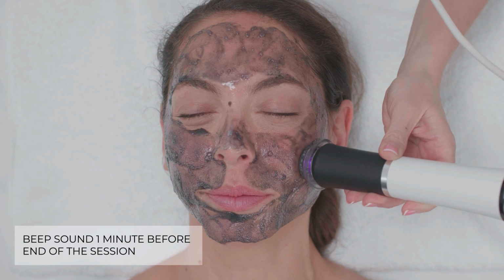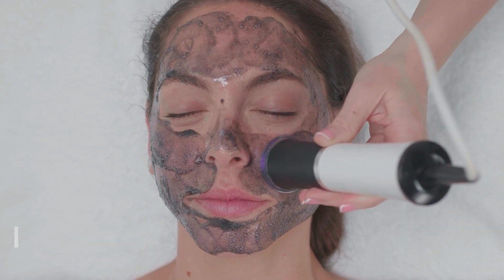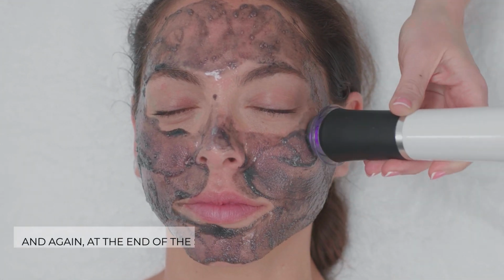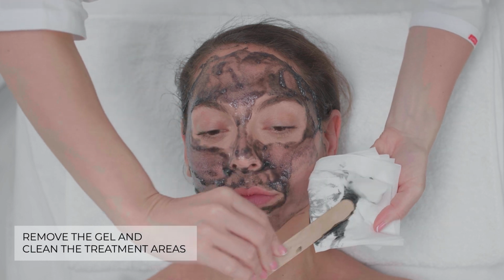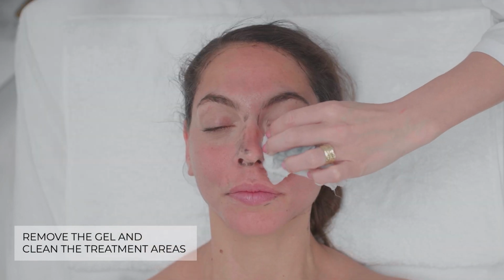A beep will sound 1 minute before the end of the session and again at the end of the session. Detach the OxyPod and dispose of it. Remove the gel and clean the treatment areas as preparation for the next step.